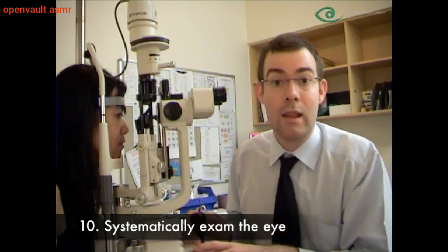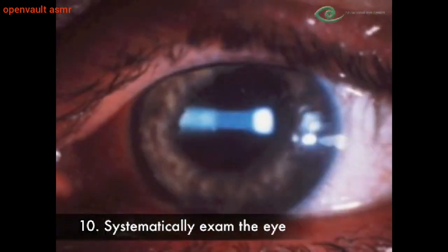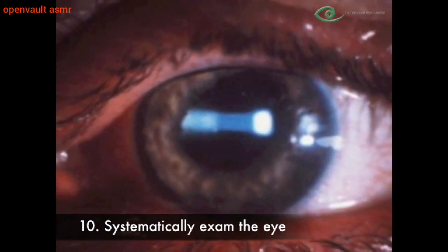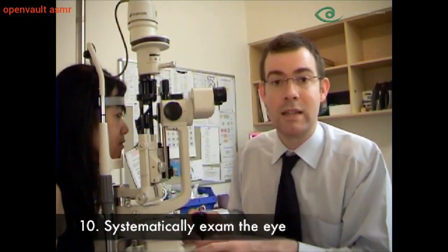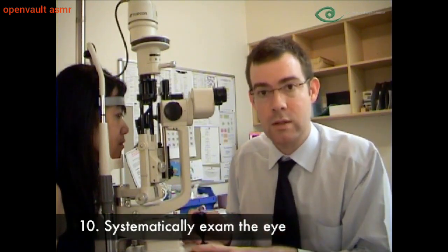Normally you won't see any light reflecting back, but if a patient has anterior chamber cells, such as an anterior uveitis, you'll see light reflecting back in what looks like dust being hit in the sunlight. Then complete your examination by examining the iris, the pupil, the lens, and the anterior vitreous.